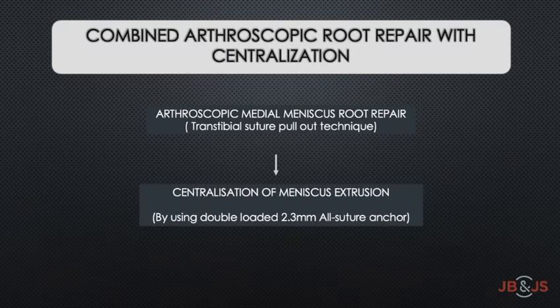The first step is to perform arthroscopic repair of the medial meniscus root tear by transtibial suture pull-up technique, followed by meniscus centralization using a double-loaded all-suture anchor through an additional mid-medial portal, which reduces the mid-body of the meniscus onto the tibial rim plateau. This gives robust strength of the repair and reduces the meniscus within the tibial rim.